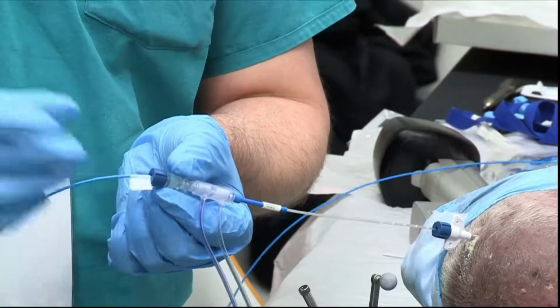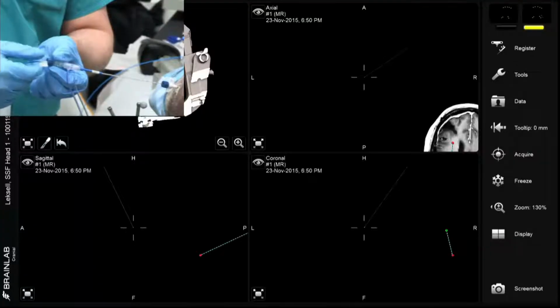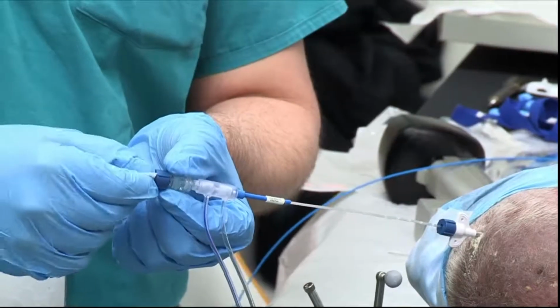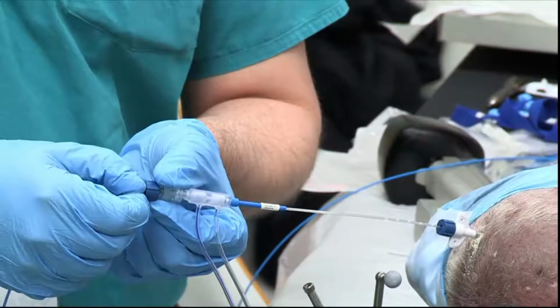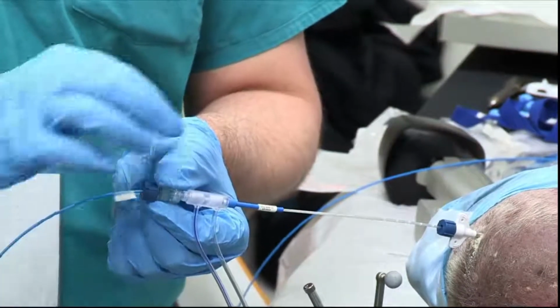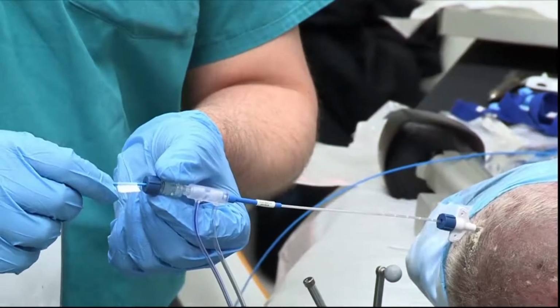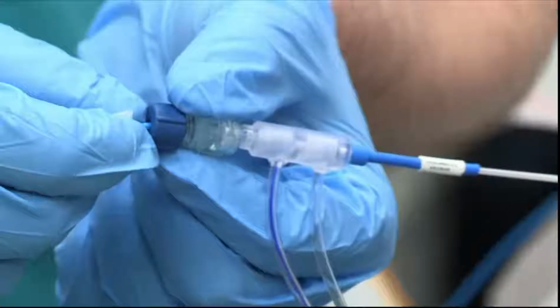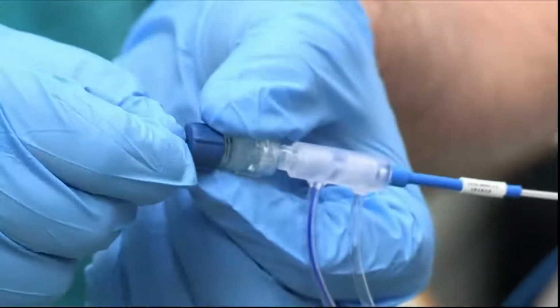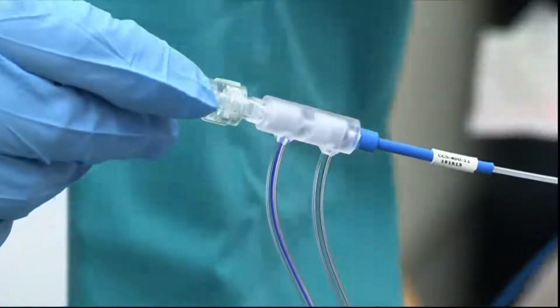Just to show you this now, and we'll step over to the software, but once you're in the MR suite, your job, once you've made an ablation, you're going to be pulling back, and basically you just pinch your fingers, and you get a centimeter or so to pull back, and this marks it. This is sterile within the cannula, so as long as that hasn't been violated, you can advance it. We haven't had to do that yet, but you certainly could if you needed to go back and burn another area. That's it. Do you guys have any questions?